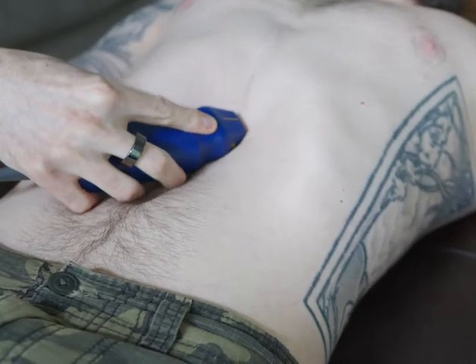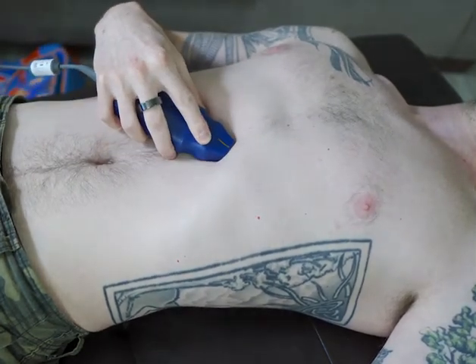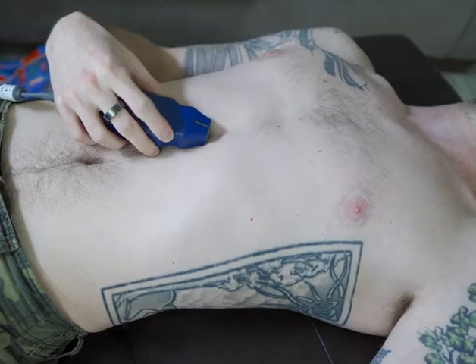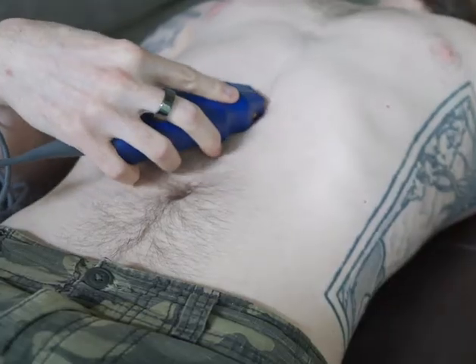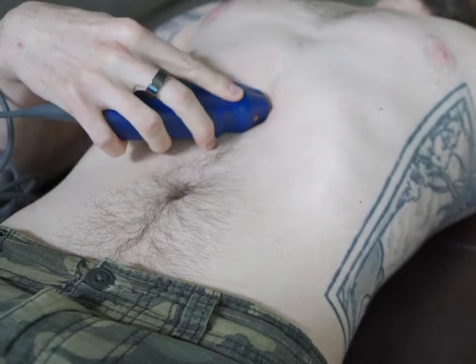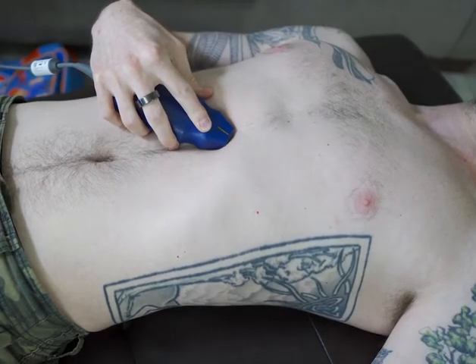Remember that the majority of the heart is offset to the left of the midline, so your probe may need to be pointed slightly in that direction. If you find that there is bowel gas blocking your view, slide your probe a few centimeters towards the patient's right in order to use the liver as a sonographic window. Just remember to compensate for this movement by rocking the probe back the other way.